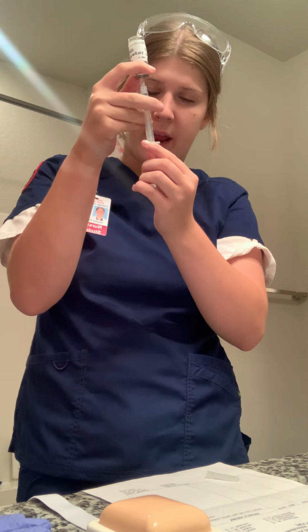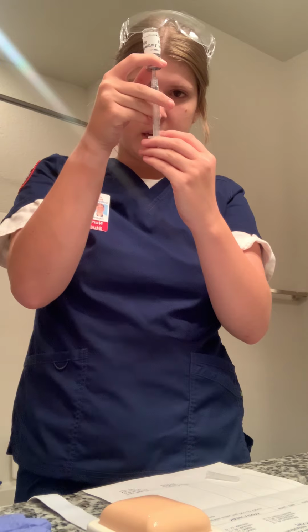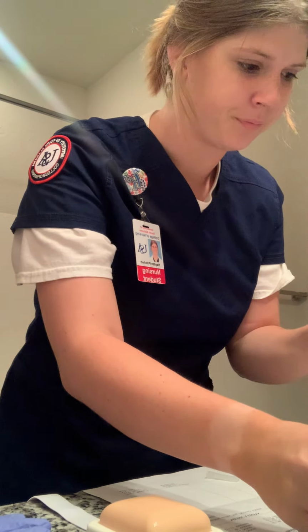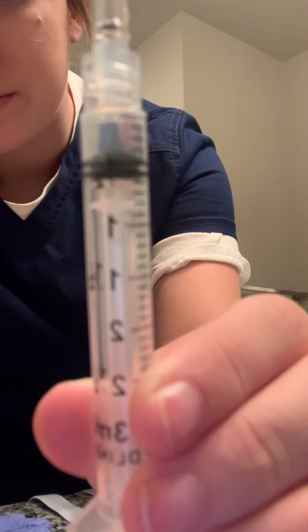And I'm going to get that air bubble out. I can pull past 1/2 to get that air bubble out. And then once I've gotten it out, I can push back to 1/2. So now that I have my dose, see if you can see that.